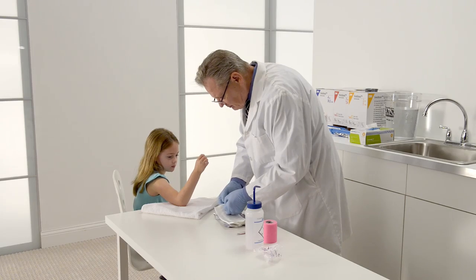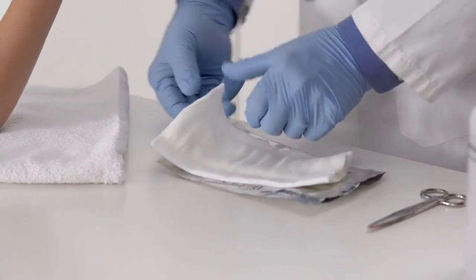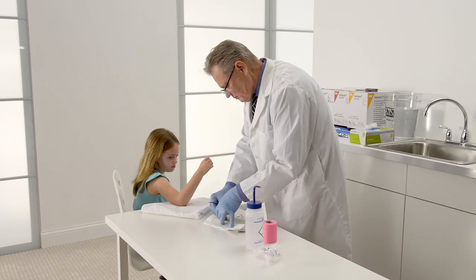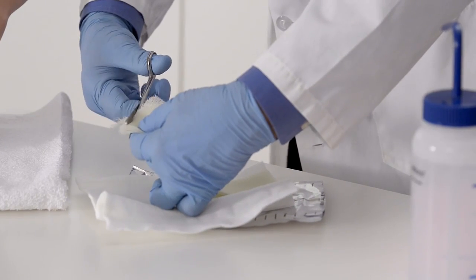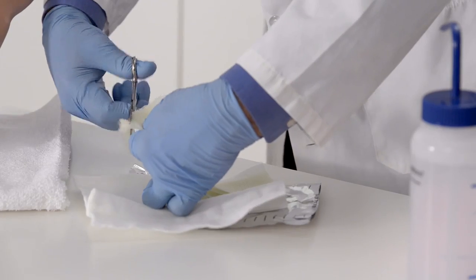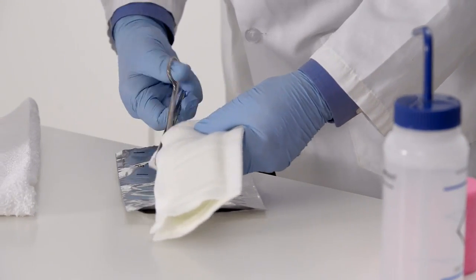To protect the patient's skin from the exposed knit fiberglass edge of the splint, open either side of the seam and peel the felt back. Expose the knit fiberglass and trim 1/4 inch from either end of the splint. Remember to wear examination gloves during direct contact with uncured resin of knit fiberglass.